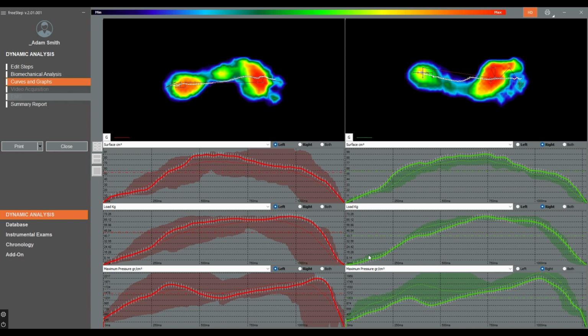On the right hand side, a smoother power distribution, a little blip here, little blip here. No one's perfect, but that's a sort of smoother arc. And then in terms of the amount of pressure, who knows what's going on. There's a high here, and then a drop, and then through, and then a literal plummet. Now what's interesting on the right hand side is this is exactly where his heel spur is. So it makes sense that that's actually the bit that his body, it knows it's there and it's trying to avoid it. And then a nice sort of smooth drop off at the end.